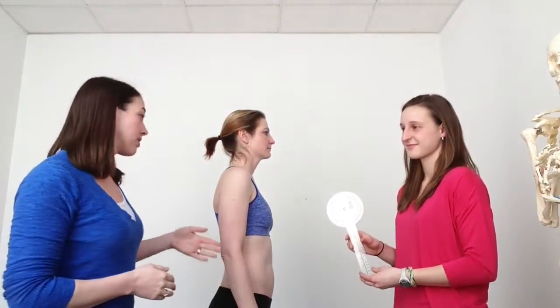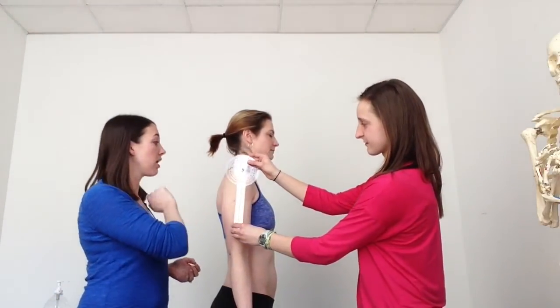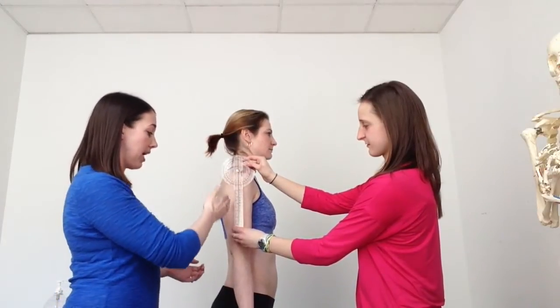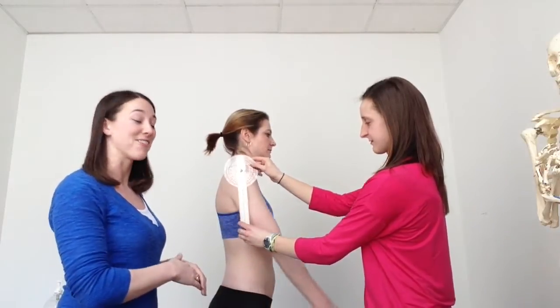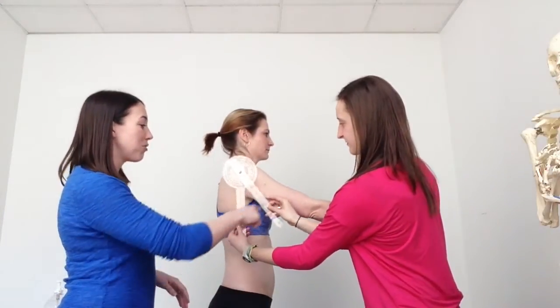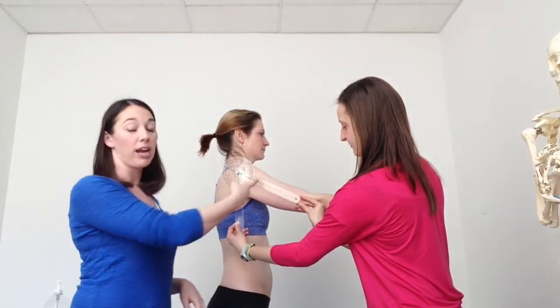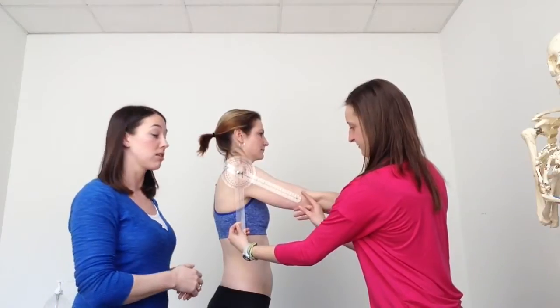To properly measure shoulder flexion, a large goniometer should be used. Your axis or fulcrum will be placed over the lateral aspect of the acromion process. The stationary arm will be lined up with the mid-axillary line of the torso, and your movable arm will stay in line with the humerus. A great landmark to use for this is the lateral epicondyle of the humerus.